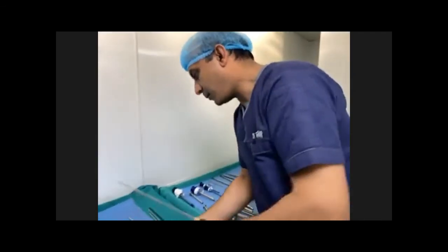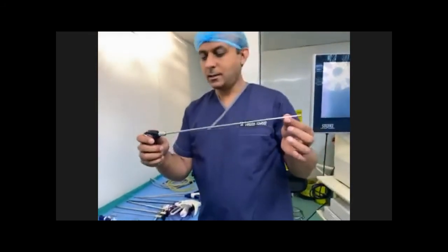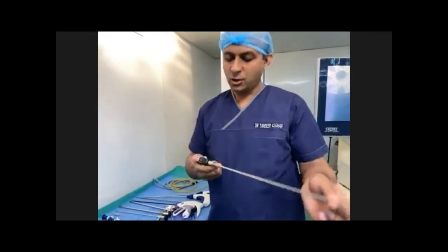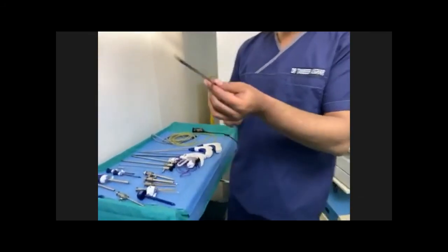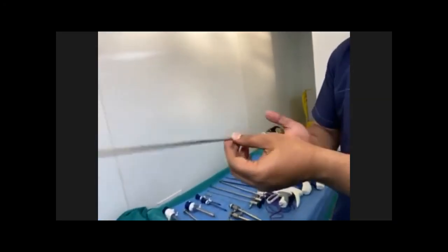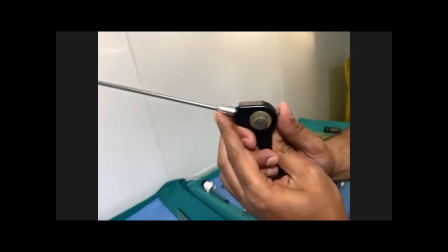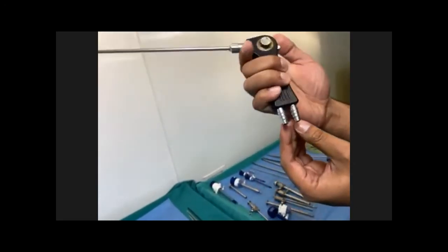Another very important instrument is the suction and irrigation. It has got a shaft. This is a 5 mm suction irrigation system. It has got a handle, and there is a knob which, if you go up, it will do suction, and if you go down, it will do irrigation.